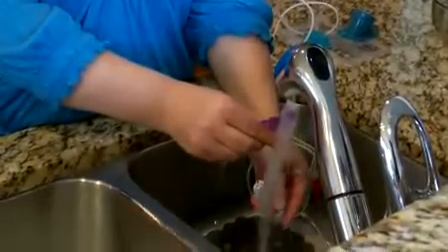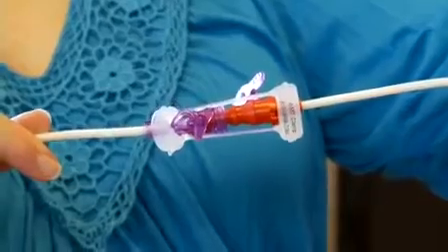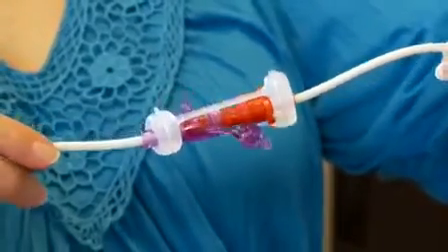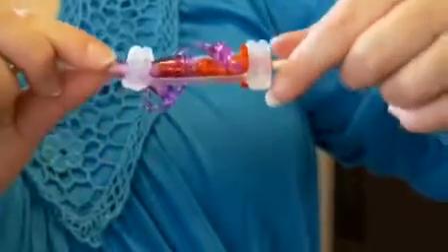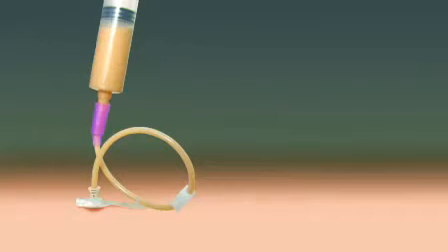When feeding is complete, flush the feeding set with the prescribed amount of water, typically 5 milliliters for children and 10 to 20 for adults. Disconnect the feed set and wash it with warm soapy water. Hang the feeding set so it dries with water dripping out. To eliminate messy feed set pullouts, try using the AMT clamp device, which secures the Y-port adapter to a stepped connector. Other methods of feeding are drip feeding via gravity or bolus feeding with a syringe. Follow the instructions given by your healthcare provider to determine the rate of flow and the best feeding procedure for you.